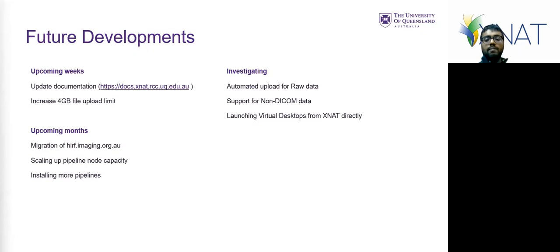There's also ongoing development to integrate the Neuro Desktop environment that we talked about with the Nectar BDS into XNAT. That's a project that is funded to deliver this by the end of this year. So that will allow a user to launch a virtual desktop from XNAT and have the XNAT data mounted. So that might be something we'll post some updates about later this year, once it's in production.